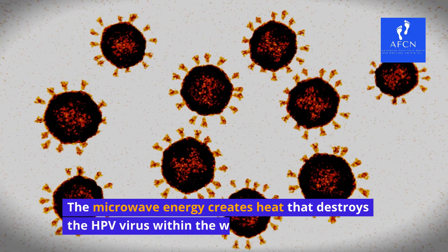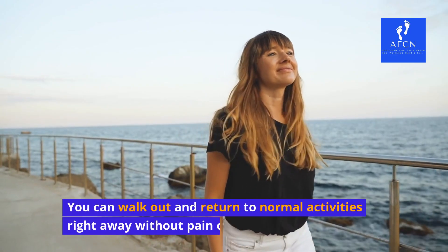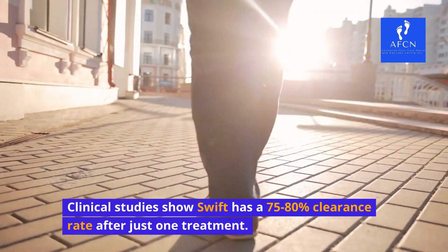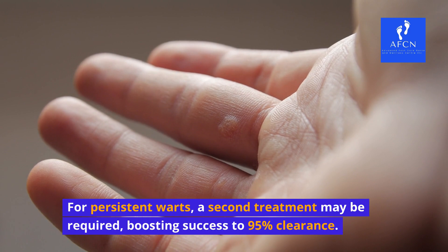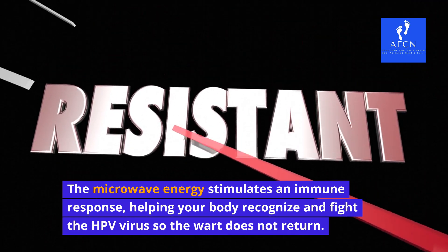The microwave energy creates heat that destroys the HPV virus within the wart. After just one 10-minute treatment, the wart will begin to shrink and fall off over the next few weeks. You can walk out and return to normal activities right away without pain or scarring. Clinical studies show Swift has a 75–80% clearance rate after just one treatment. For persistent warts, a second treatment may be required, boosting success to 95% clearance. The microwave energy stimulates an immune response, helping your body recognize and fight the HPV virus so the wart does not return.